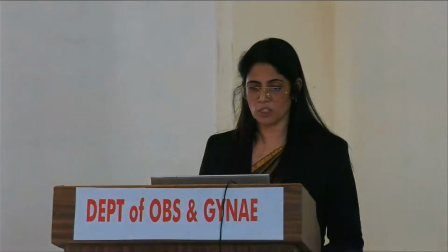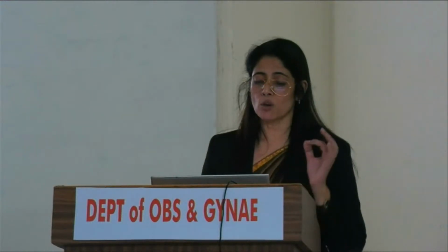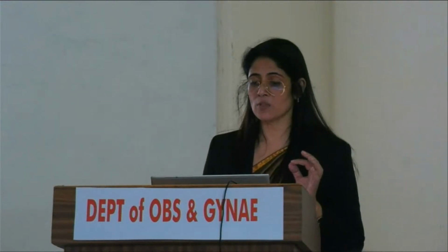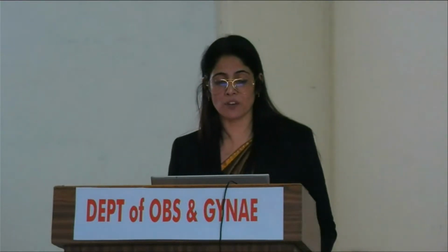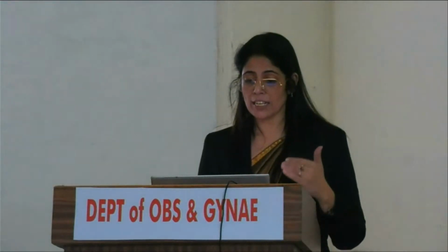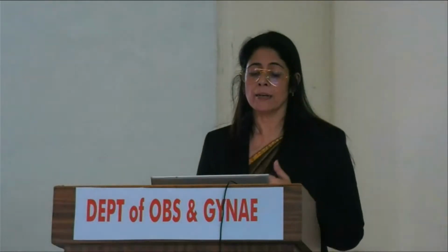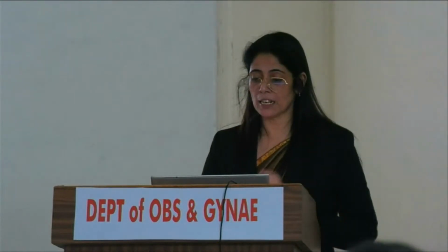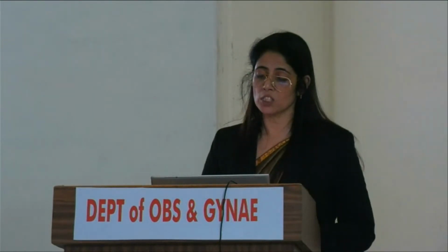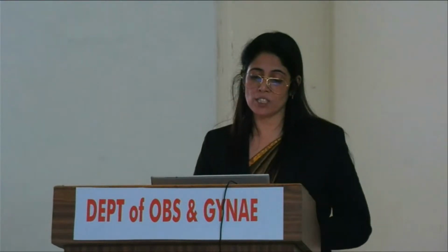Finally, the patient decided to terminate. So the take-home message is that when you're doing an 11 to 14 week scan, you should always try to follow the FMF guidelines for the NT, nasal bone, the ductus venosus, and the TR for accurate measurements. You follow a checklist. Beyond that, you always have to look at the fetal anatomy, follow that checklist. But we've got to remember that the first trimester ultrasound examination of the fetal anatomical survey does not replace the traditional second trimester ultrasound, but is rather complementary to it, especially in a high-risk pregnancy.